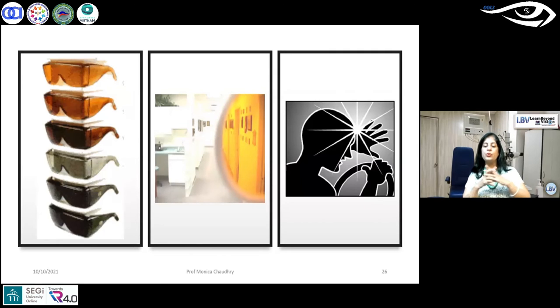So the whole story is, I don't need devices. I need a smartphone. I need these software. And yes, of course, for my mobility and other things, we need to do one more thing. The most important thing which you all miss out is to enhance the contrast. How many of you would have prescribed filters to your low vision patients? Look at it, it is here.